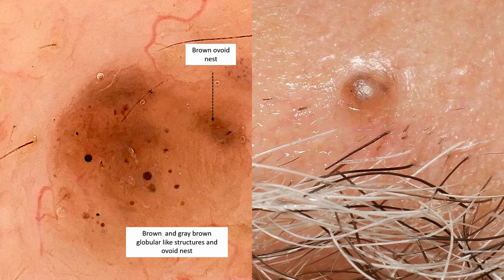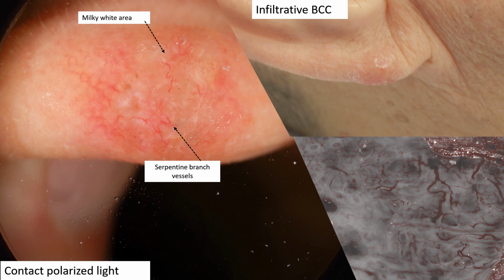And in this case, this dome-shaped lesion dermoscopically has brown ovoid nests, as well as some brown and gray-brown globular ovoid structures, which are characteristic of a nodular pigmented basal cell carcinoma. And you can see it's just above his brow.